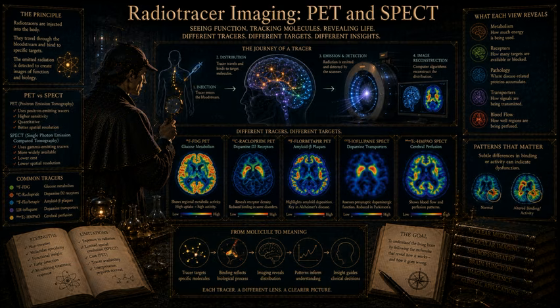The initial hurdle is transduction. High-energy gamma rays are incredibly penetrating. They pass through the patient's skull with ease, but unfortunately, they also pass right through standard electronic components. If you just put a silicon microchip next to the head, the gamma ray would ghost right through it without registering. Just completely ignore it. Yeah, precisely. So we have to stop the photon and force it to reveal itself.